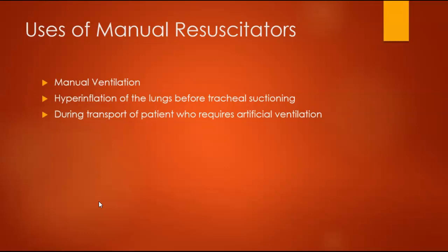We get really excited about intubations and some of the other things we do, but being able to effectively ventilate somebody with just a mask and a manual resuscitator and maybe an airway adjunct is super important, because you're going to be in situations where you're having difficulty intubating, or it's taking the person that's performing the procedure a little bit of time to get to the bedside. So you want to make sure that you're ventilating the patient adequately. Your ability to open the airway, create a good seal with the mask, and ventilate appropriately is going to be important.